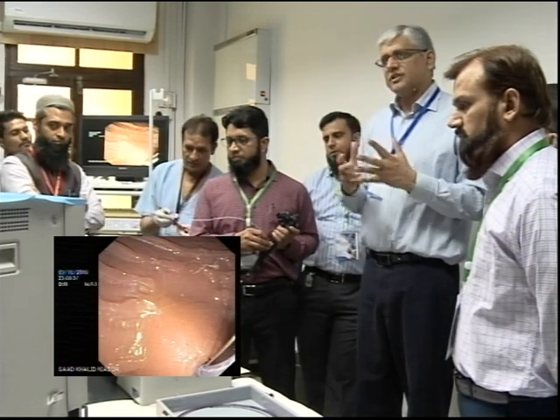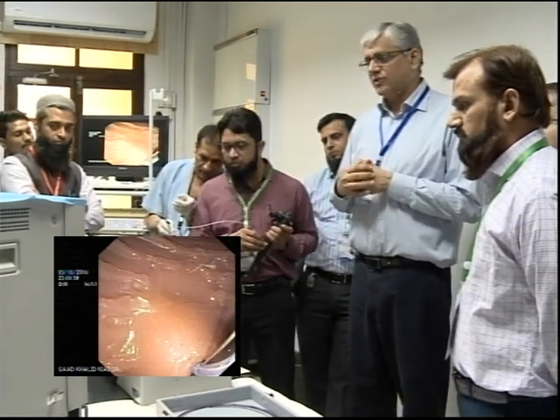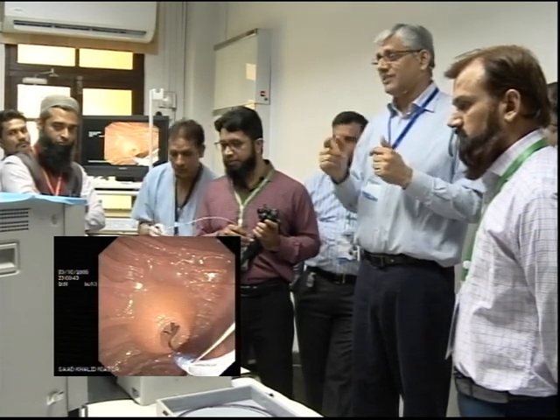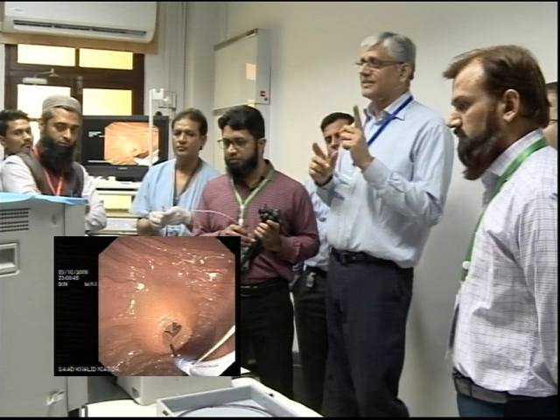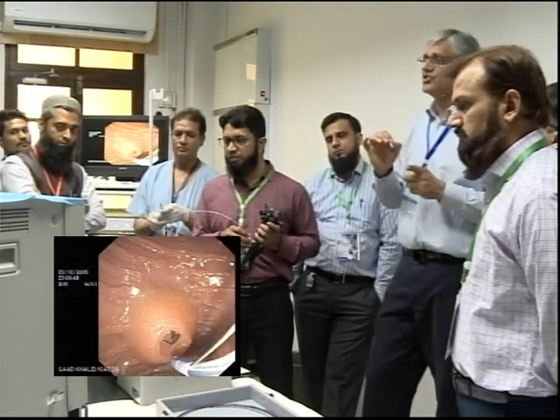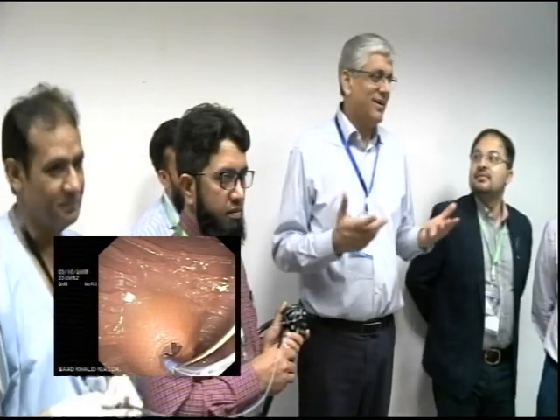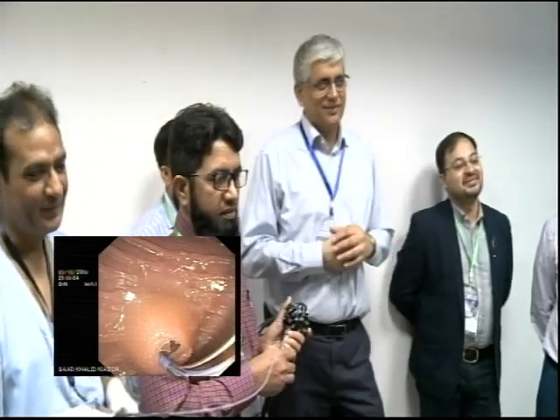So similarly with the wires. So when you go to the workshops and you see the experts just doing everything, remember also there is an additional advantage they have. Everything is new. If you give me a new sphincterotome and a new wire, things are easy.